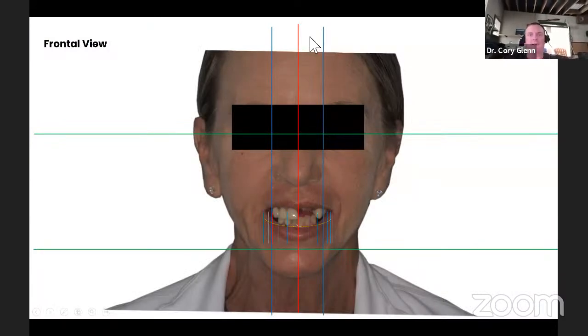All right. Let's see questions. Which software can we use to compare and evaluate two STL files? It depends on how you want to compare the STLs. BlueSkyPlan lets you import an STL and superimpose it, and you can compare model outlines.